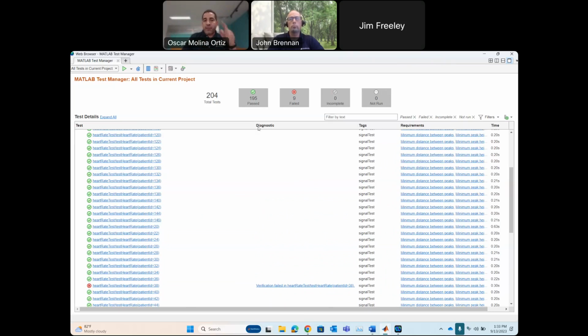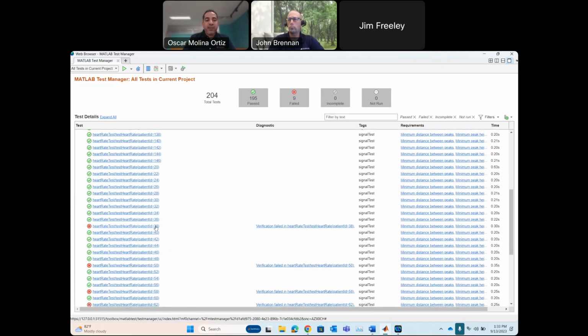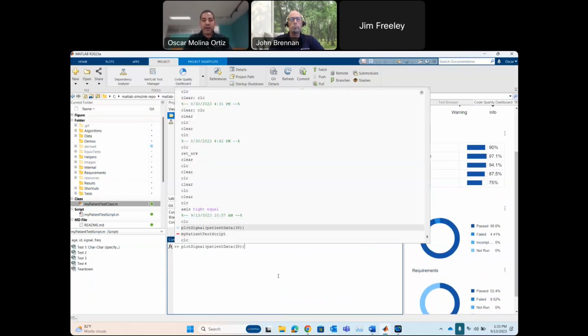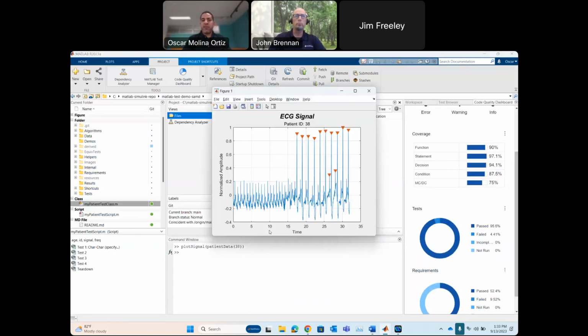Couple more things to notice before we get into patient 38 right here. Actually, we can do it right now. So if we think about this data, you might think, okay, what went wrong? Is it the algorithm? Is it the data? Did I hit an edge case? What really happened there? So here I'm going to show you what happened with patient 38. So let me just clear my screen very quickly and then run this function. I just created this function myself just to plot the ECG signal data and see what's going on with this patient 38.